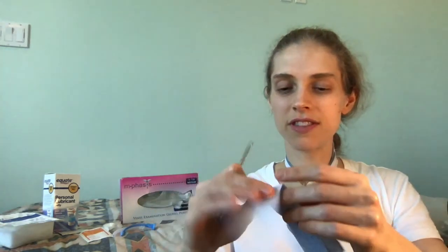And then you're just going to have this tail, and you're not going to need this tail. You're going to take your scissors and cut this off, and it's going to make it shorter and give you an approximate length. So when you do the tracheostomy tube exchange, you can get this on quickly before your tracheostomy tube falls out.